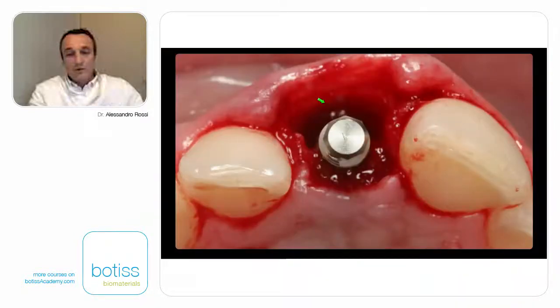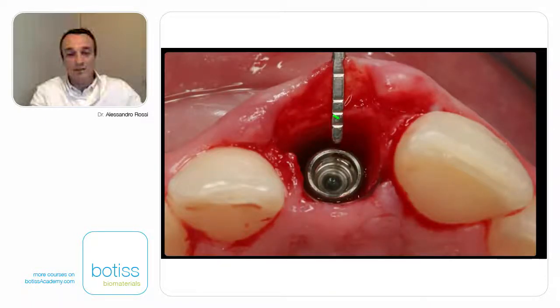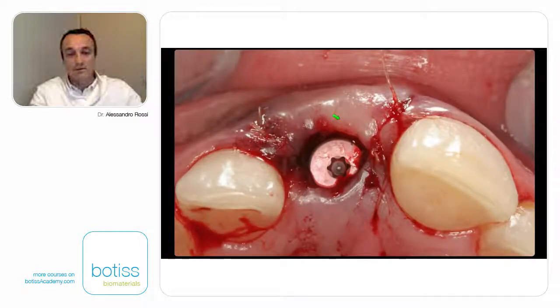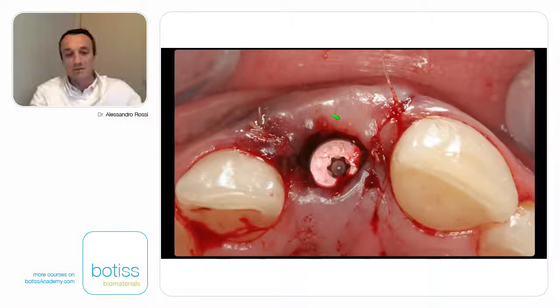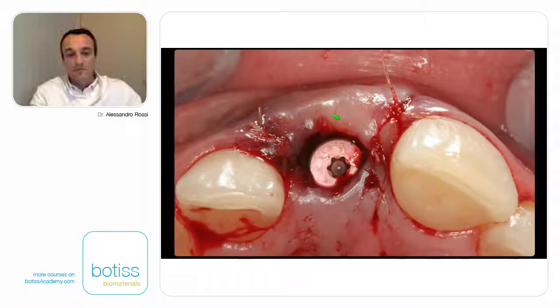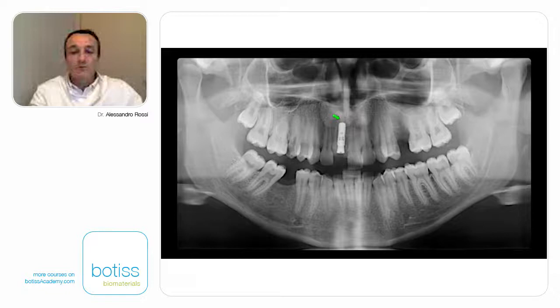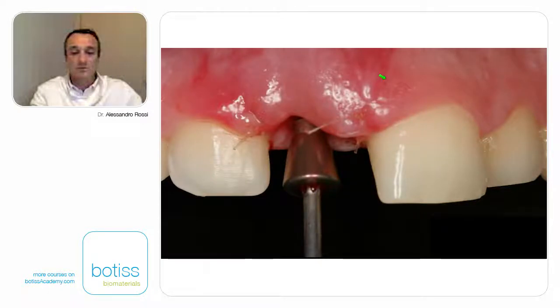Here are the phases of implant insertion into the alveolar socket. We then evaluated the gap between the buccal bone and the implant, measured this gap, and decided not to fill anything between the bone and the implant. We preferred — and decided together with my prosthodontist Dr. Diego Lopes — to have transmucosal healing in order to have an immediate restoration. At the end of my surgery, the patient was in this condition, and the prosthodontist started to prepare the provisional crown. Here is the radiographic control of the implant insertion.